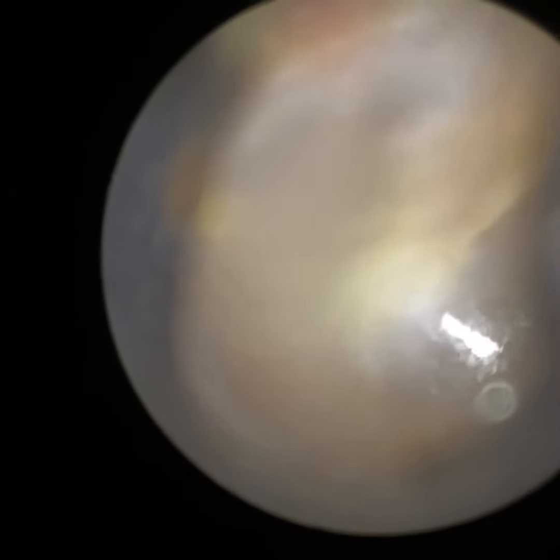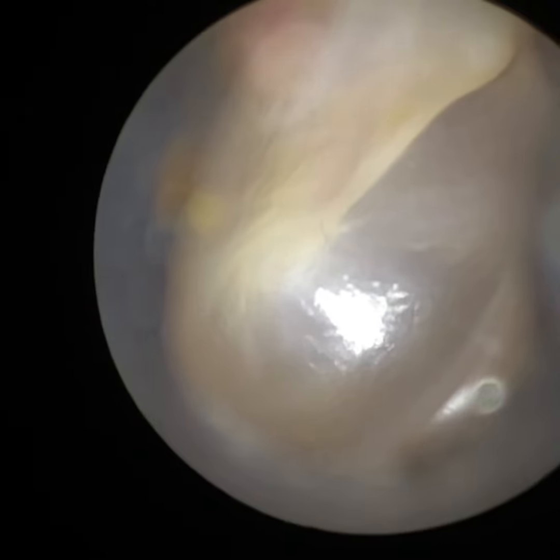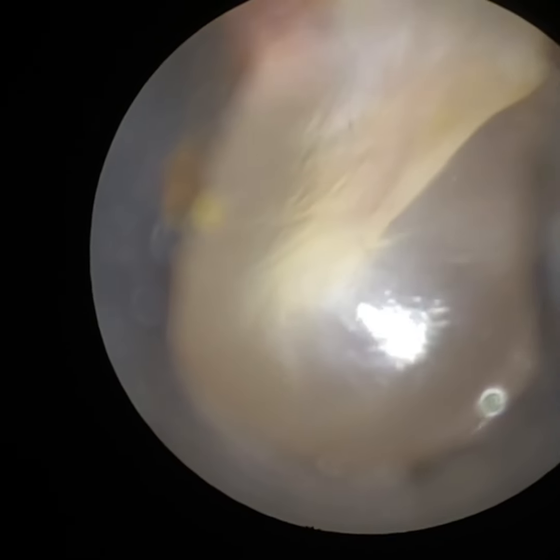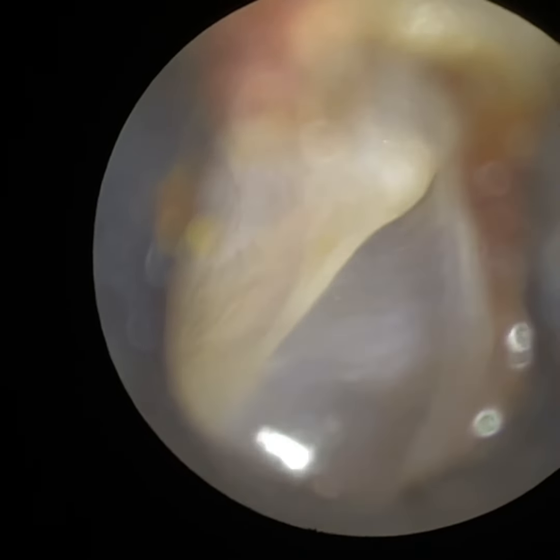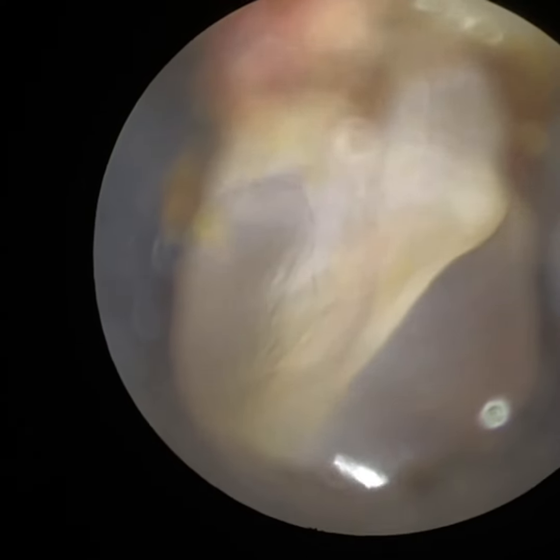I'm just going to enter the ear again and dilate that. You can see a stunning view of the patient's eardrum. I'm just having a good look around, inspecting all around the edge — you can see the anterior, the posterior, the superior, and inferior quadrant.